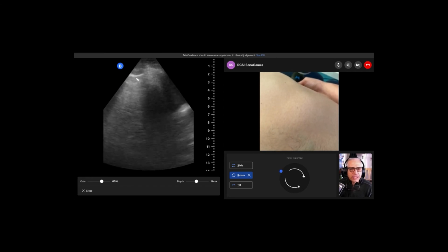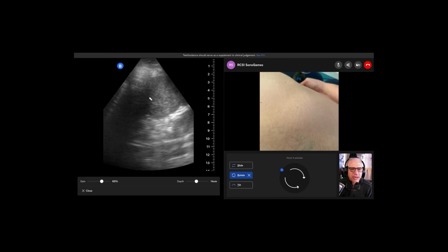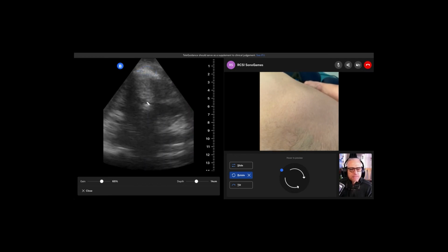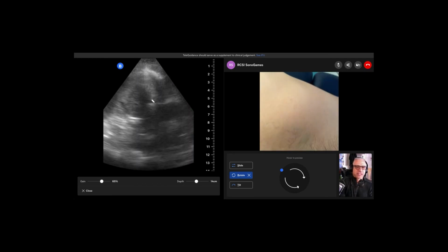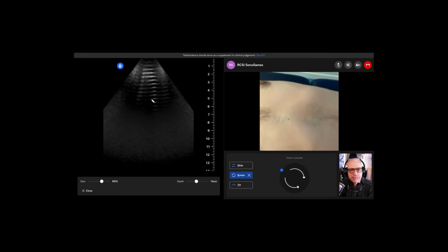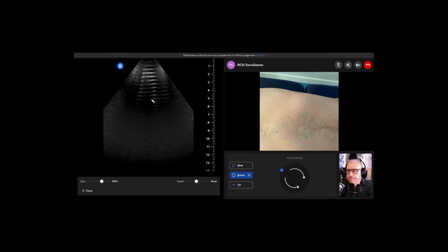And there you can see there's lung. So you have to mess around to try and see. And there's a little air here, so you probably need more gel. But you want to see if you can just slide and fan around and see if you can see that little bit of diaphragm between spleen and diaphragm, or that area.